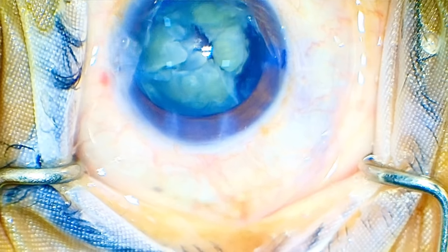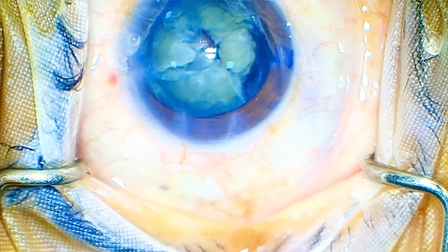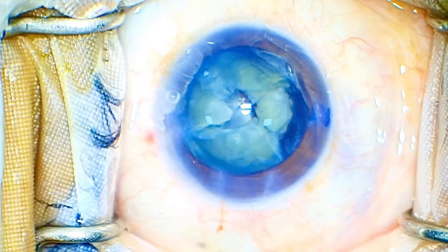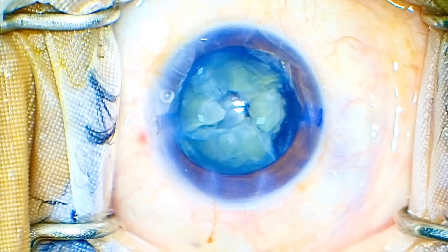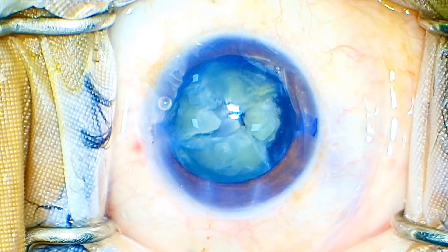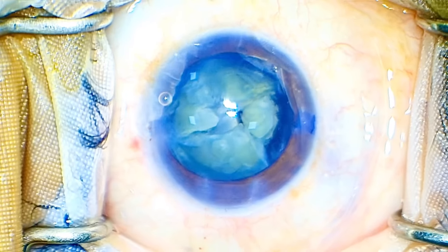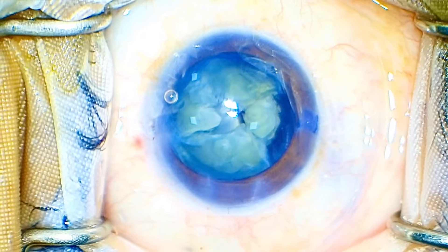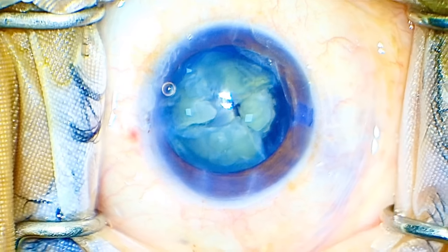Now, being beginner surgeons on the initial steps of your surgical career — what would you have done? If you are stuck in a case like this, what would you do? You don't have a spare FACO in your OT, you have to complete this case, you have to give this patient a beautiful result — and the patient is a VIP lady. I have asked my OT assistant to remove the tubing, reapply it, and prime the FACO once again, just in case there are some technical glitches in the software or hardware.